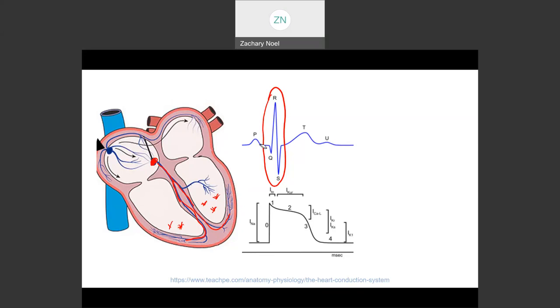If we were to look at this bottom figure, which is showing you the ventricular myocyte depolarization, we see a very rapid phase 0 upstroke here during the depolarization process. And then, of course, it comes down and repolarizes. And we see how that correlates with the QRS complex. But in a situation where we have a monomorphic or polymorphic VT, what we might see instead is this slow depolarization that occurs, and then the repolarization is delayed too. And this would manifest, again, as a wide QRS complex because we're looking at time here. And the longer it takes to depolarize, the wider that QRS complex is.